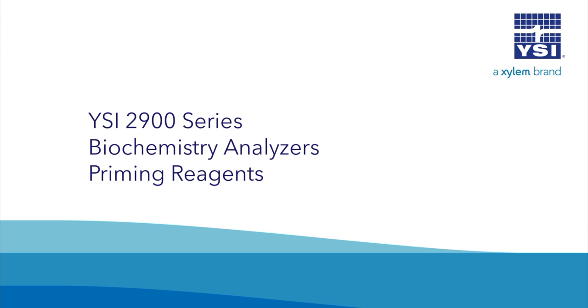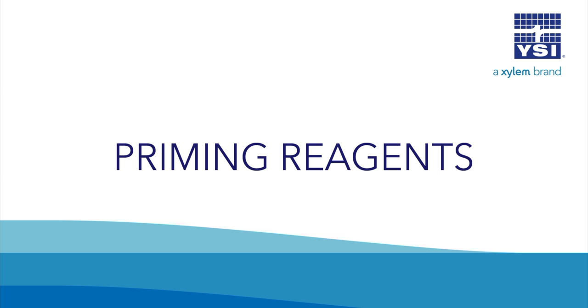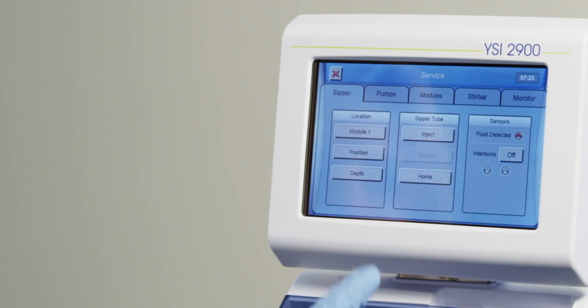YSI 2900 Series Biochemistry Analyzers: Priming Reagents. Select Service, and then Pumps.